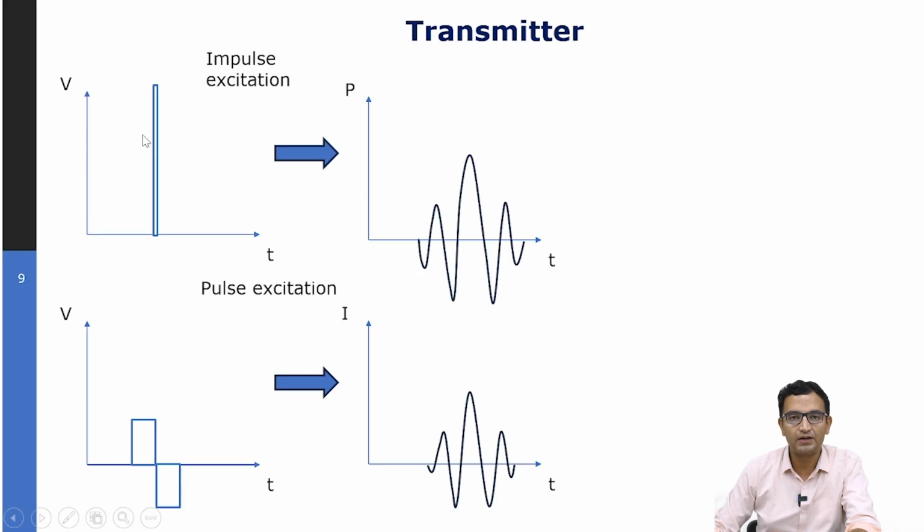Typically the transmitter contains hardware for exciting the transducer, and we can generate an impulse for generating the signal from the transducer. When the transducer is excited by an impulse, it will actually result in the impulse response, which can typically be modeled as a Gaussian modulated sinusoid. So this is a typical pulse. Now it turns out, rather than impulses, generally we use short pulses, or we have pulses which have different phases. So this is a biphasic pulse here. You can use these different kinds of excitations to generate the transmitting pulse.